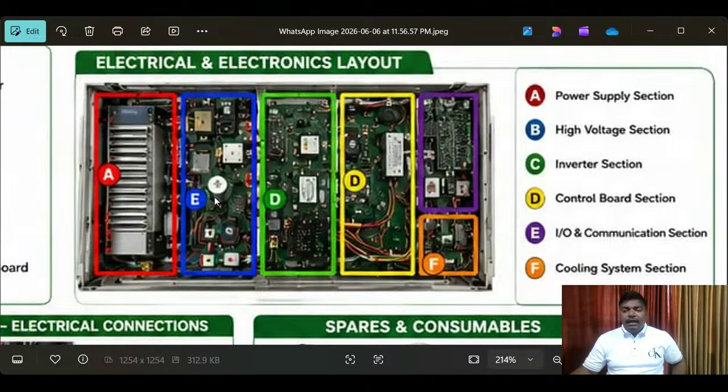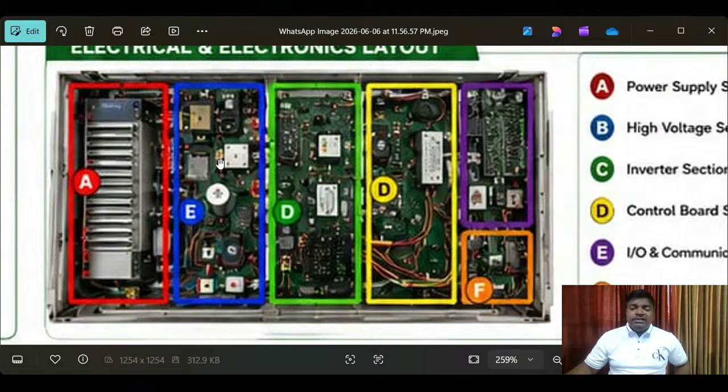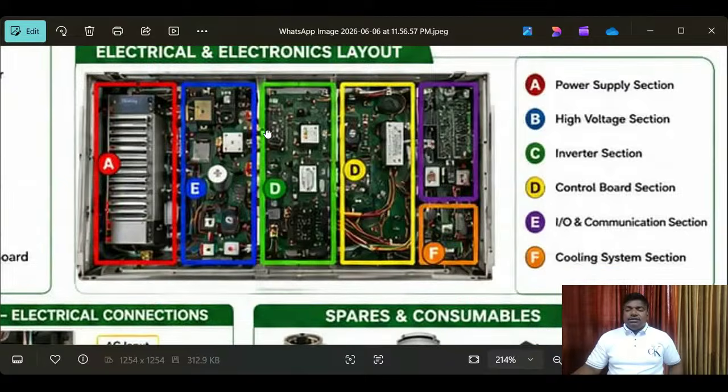Second point. In high voltage, what are the components that are there? Then you have to check it. You have to find out. Here it is completely 100% visible. But when you go practically, don't touch anything, and keep the power switched off. Okay. When you go inside the equipment, then you have to switch off the equipment. Okay. Main thing. It is very important. And you have to take the safety precautions and safety protocols and try to communicate with your seniors. Okay. Without a senior, don't touch this equipment. Don't be over smart. Okay, right, this is my advice.